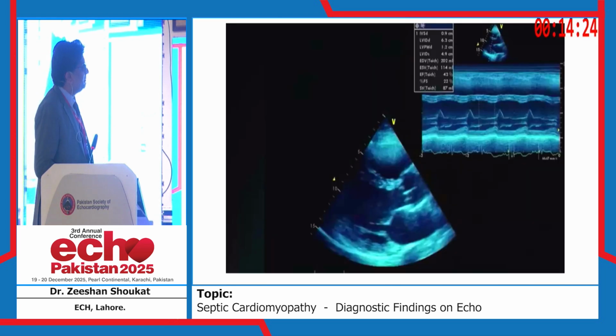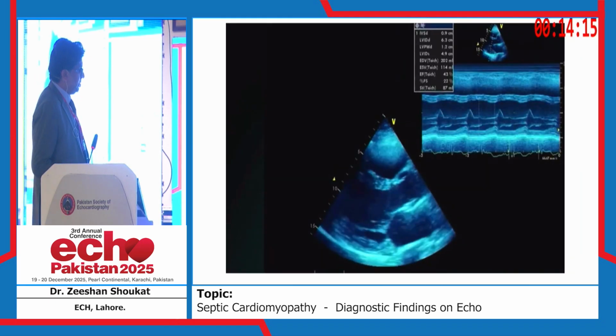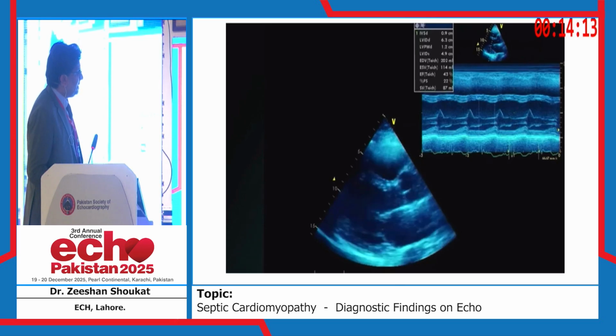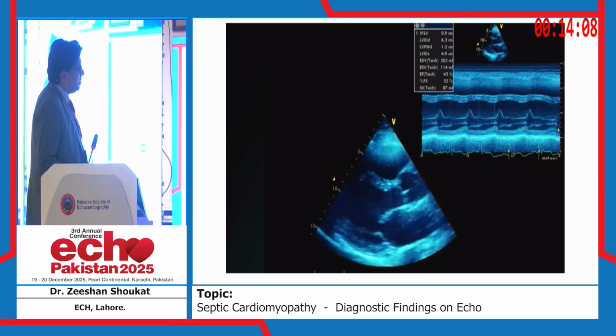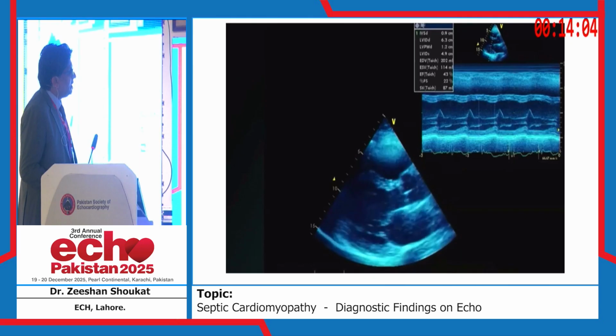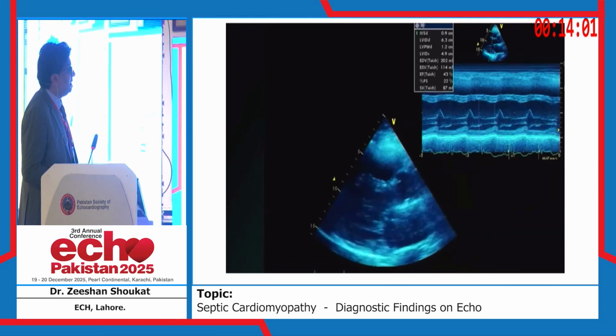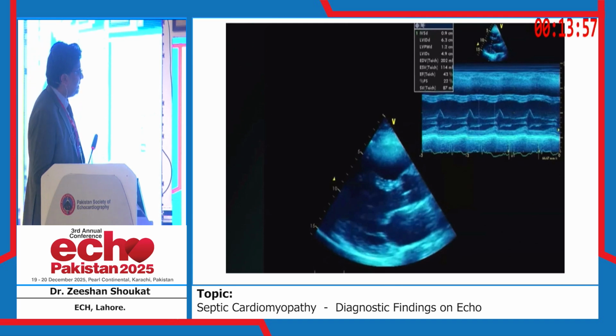Quickly, we were called for echocardiography, and you can see, can you play this, please? You can see a mildly dilated LV in the parasternal long axis view, and a moderately reduced ejection fraction around 40-42%. You can see the EPSS is on the higher side, but there is also some dilatation of the RV. So it's a moderately reduced global ejection fraction.